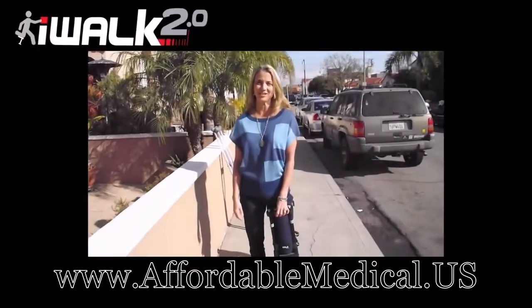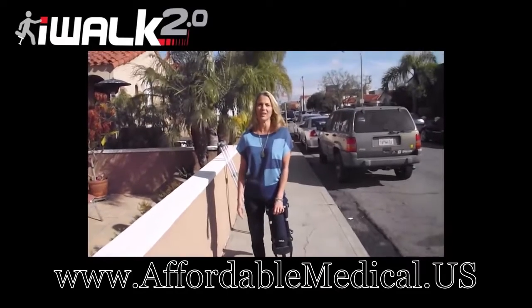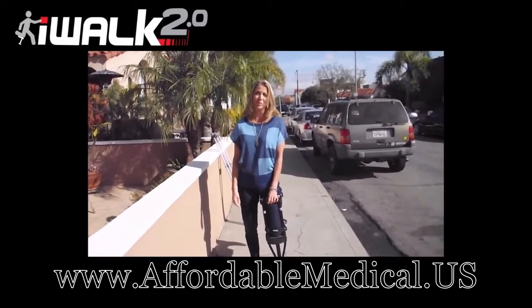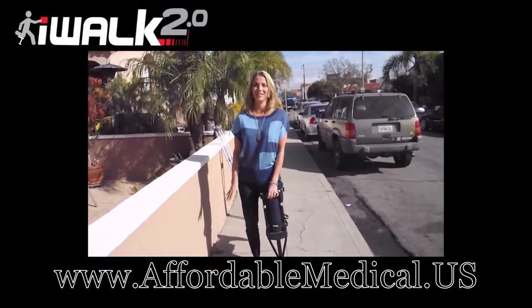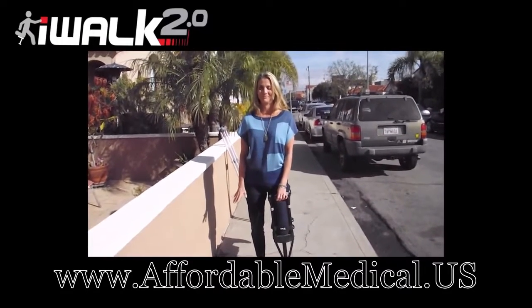My name is Christy Kale. I am 46 years old. I had a torn left gastrocnemius. I've been on crutches for about a week now, and I've been miserable. So I'm a little nervous, but I'm really excited with the idea of walking with this iWALK. So, here I go.